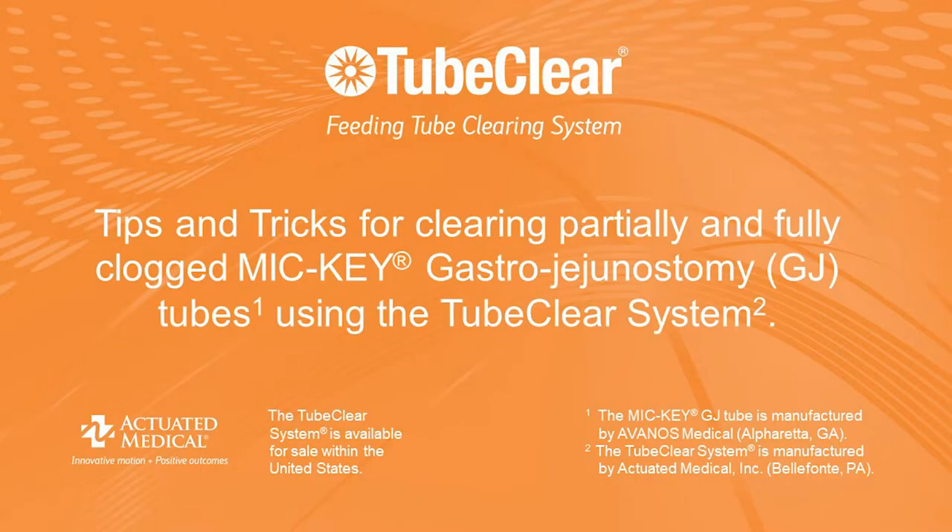This video presents tips and tricks for using the TubeClear System and GJ Clearing Stem to clear a MIC-KEY gastro-jejunal feeding tube.